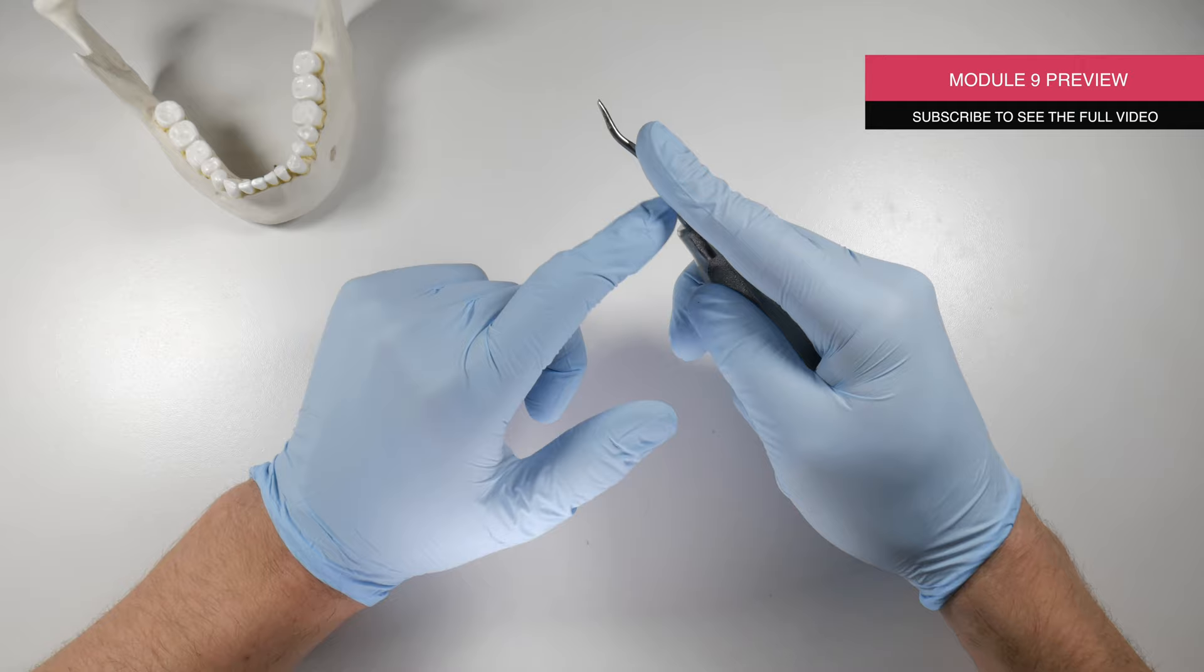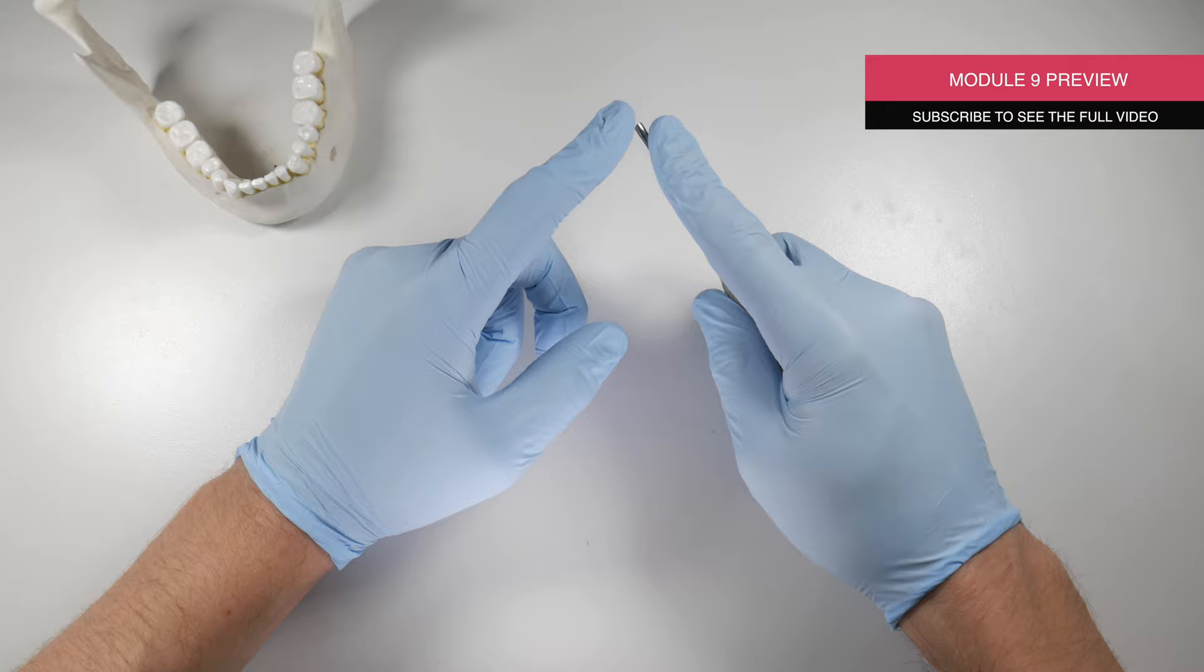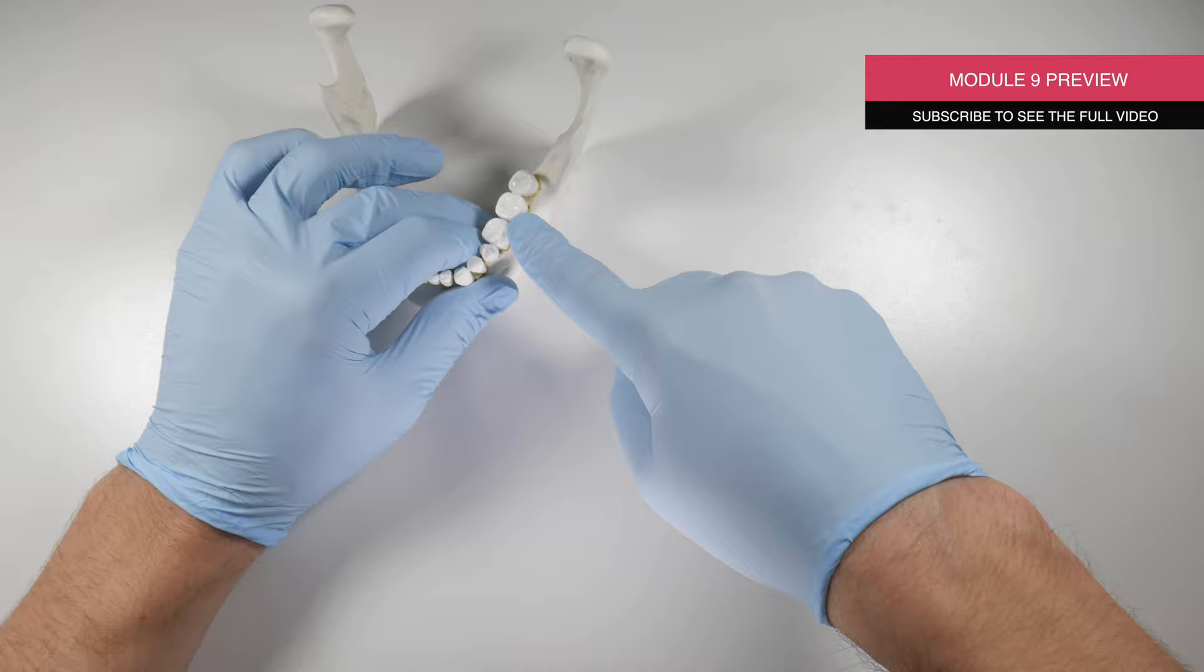The index finger will extend along the shank of the elevator and we're going to apply our finger near the tip of the elevator as a point of stability and a way to keep us from inadvertently slipping as we're elevating and poking or puncturing our patient.